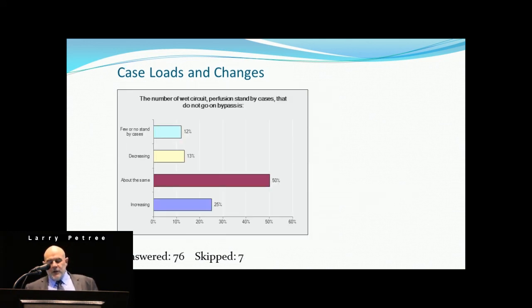The next question was the number of wet circuit perfusion standby cases that do not go on bypass, and I asked that by percentage. That big bar in the middle there is 50% for about the same. So that's not changing. But what's really interesting is the increasing is at 25%. That means we're seeing more cases where you've done a wet pump standby, but you're not getting perfusion experience, just did the setup. So those standby and no bypass cases are a significant part of the caseload that we serve.